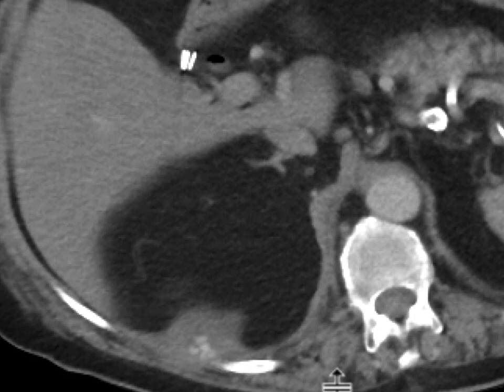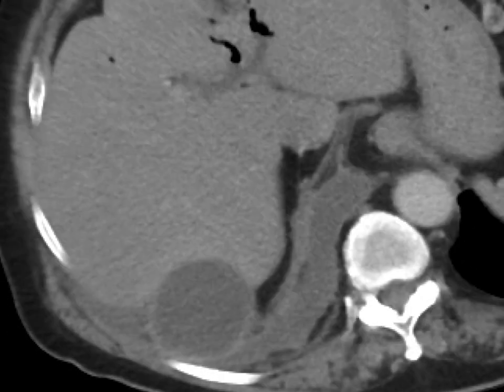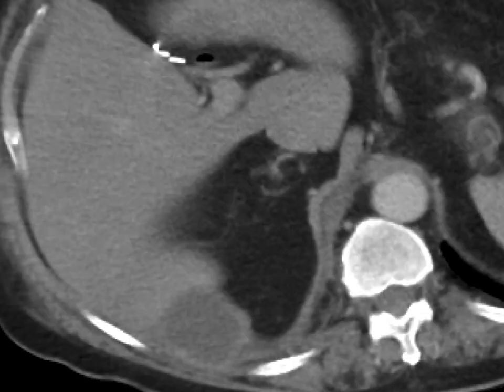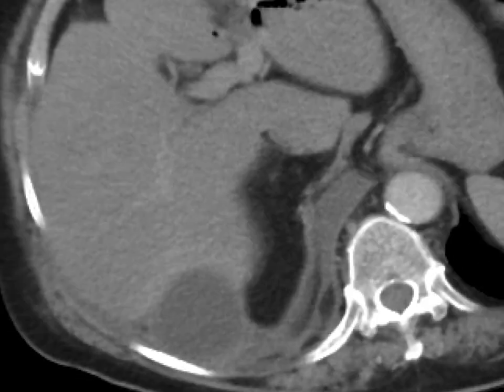Having dropped gallstones itself may not be a big deal — patients can live with this and can be asymptomatic. But they can form collections and abscesses associated with them, as in this case.